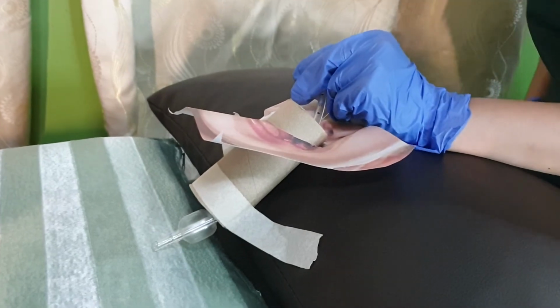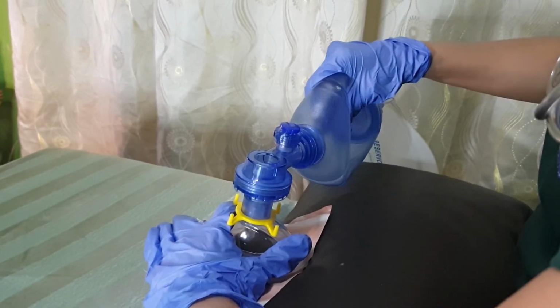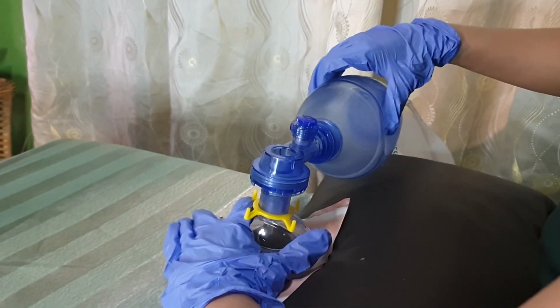So first, deflate the pilot balloon and extubate. Go back to pre-oxygenation and do bagging. Remember, oxygenation is very important. Make sure the patient is stable enough before attempting to do the endotracheal intubation again.